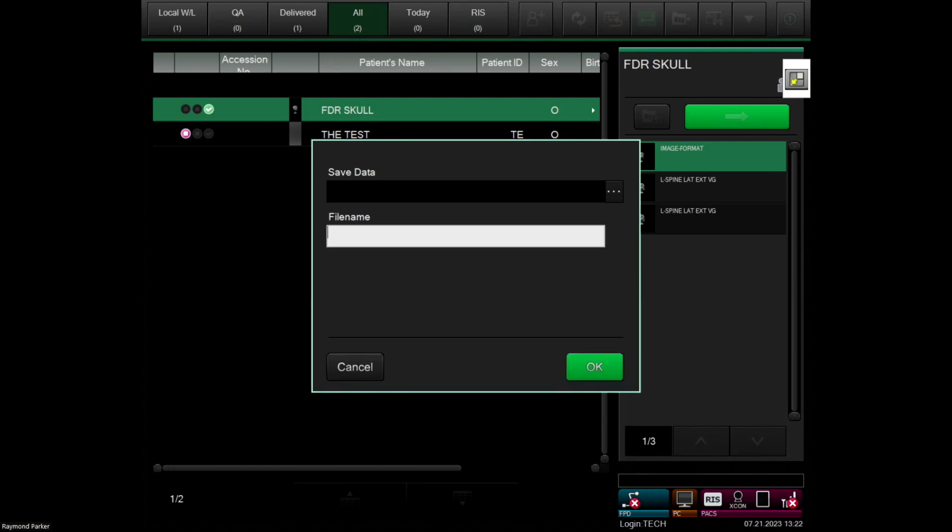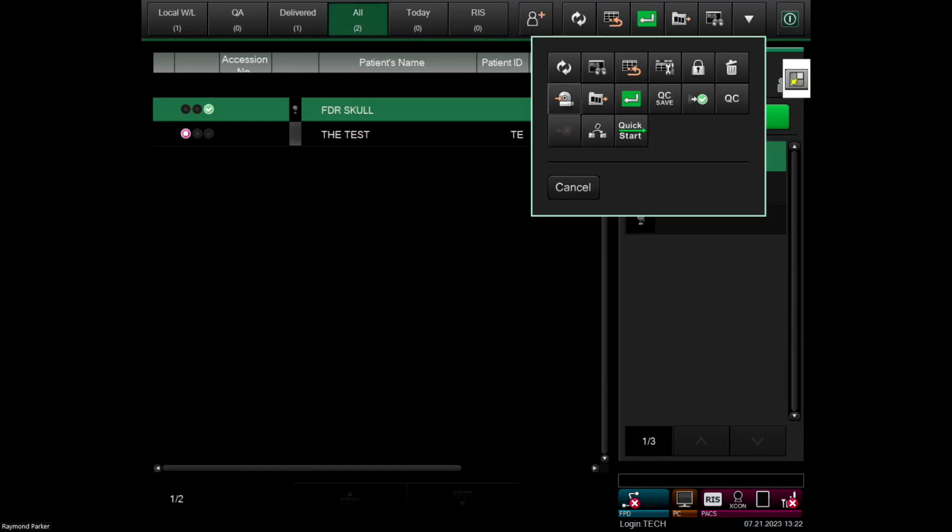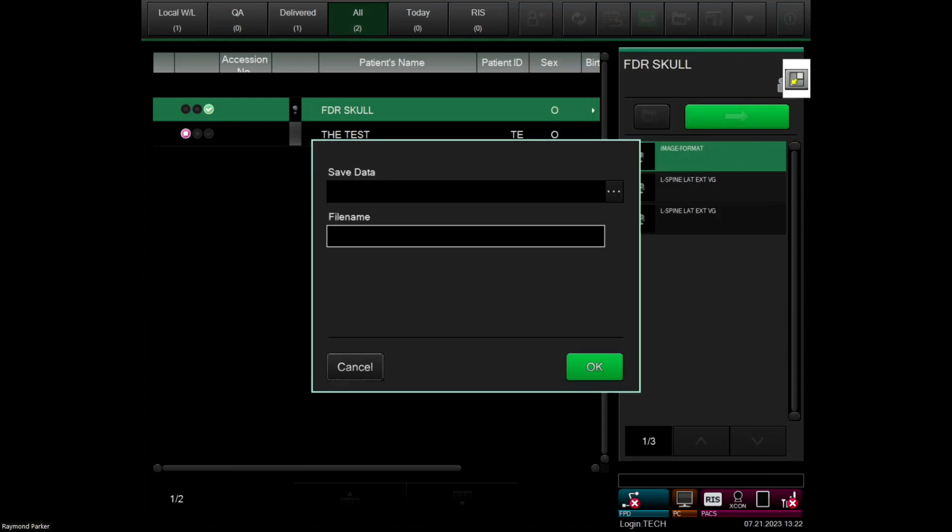I will warn you all that if this is a large number of images, burning this to or sending this to that USB stick can take a pretty good length of time. Even in some instances on scoliosis, not that you do many scoliosis on your portable, but any platform, it will take a minute or two for you to burn or send that study to the USB stick. It does take a period of time. So it was the down triangle, USB stick, CD area, click it, and then type in the appropriate drive letter as well as the file name convention.